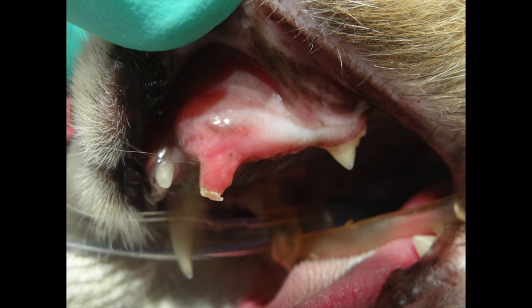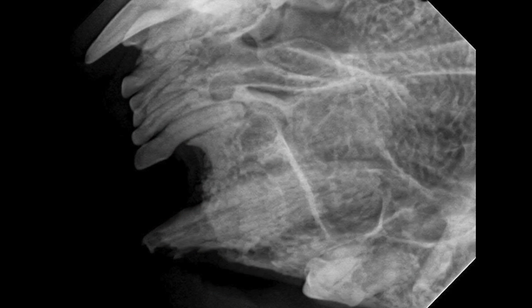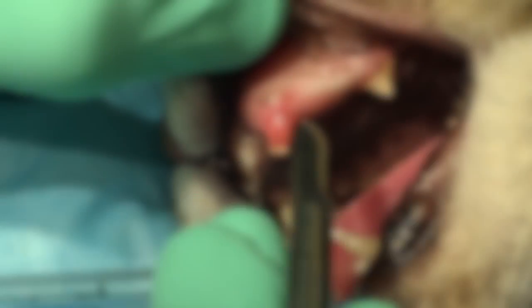In a cat. You can see here that we have the left maxillary canine tooth. We have some vestibular bone expansion above the region where the gingiva has grown into the defect, which has almost destroyed the entire crown of this maxillary canine tooth. Radiographically, we can see tooth resorption is significant, and the apical portion up into the crown is completely destroyed.